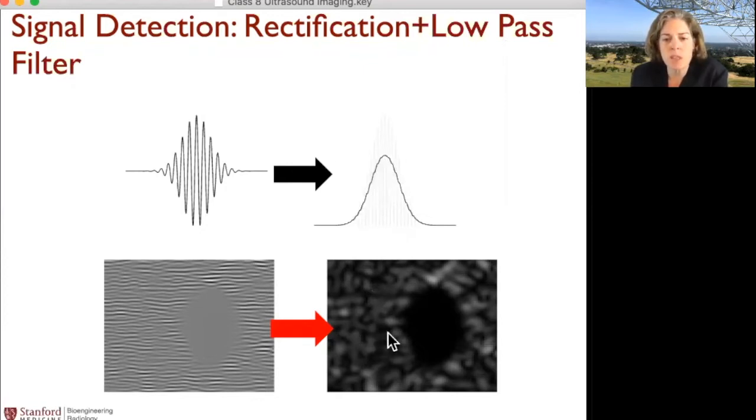You can see that there are these areas which have a high echo signal coming back, and the envelope is going to be really high, and you get this bright blob right here. Bright blobs, and you have dark blobs. And then this right here is a cyst, so it's like a bag of fluid. There isn't anything much that's going to give rise to echoes from the bag of fluid, and so it's going to be really dark in there. That's called anechoic, which means no echoes coming back.